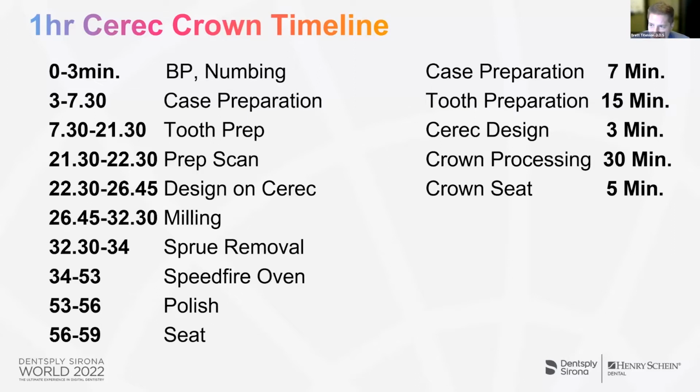So I said in my video, I took 15 minutes on the preparation, and that's including scanning, and I'm sitting down to design. So once it's scanned and you're looking at the design, 3 minutes, all right? From the time I sit down to design the crown to the time it's in the mill, only 3 minutes. That should not take long.